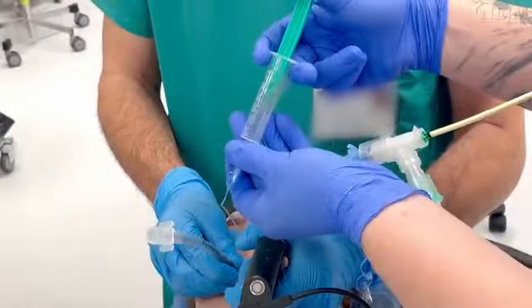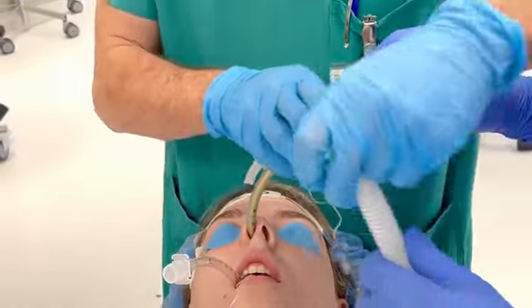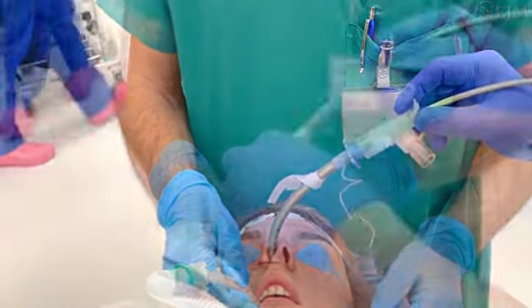In this video, we demonstrate video-assisted endotracheal tube exchange with the use of an airway exchange catheter, a technique that is particularly useful in patients with a difficult airway.